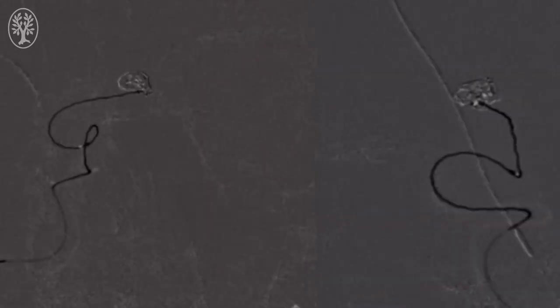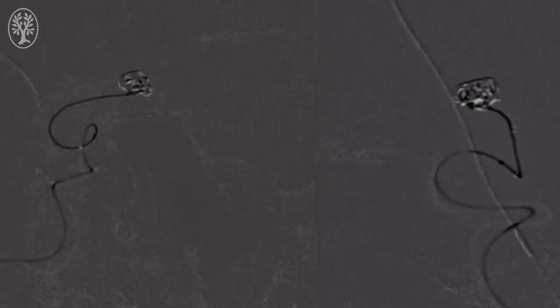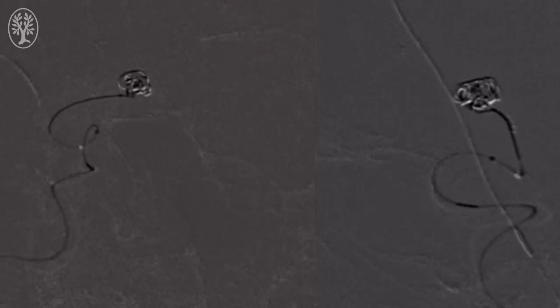Here you can see we continue to coil the aneurysm to our satisfaction, and once we feel it's satisfactorily coiled, we will remove this microcatheter.